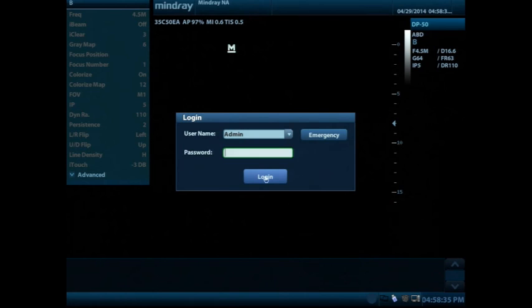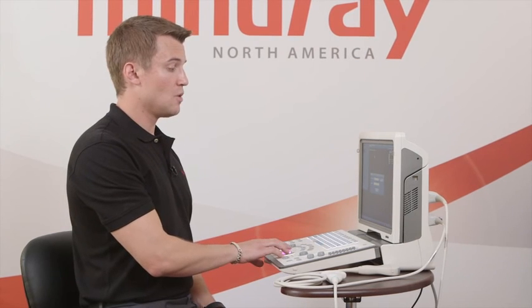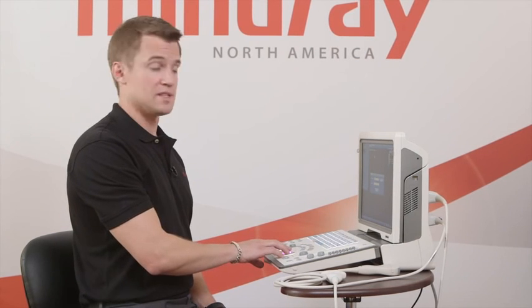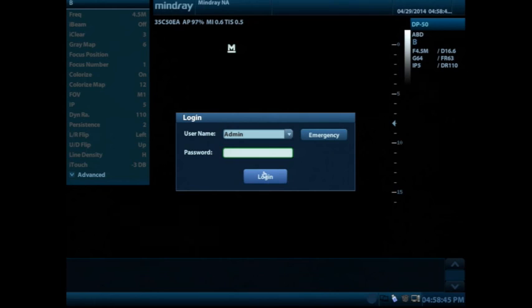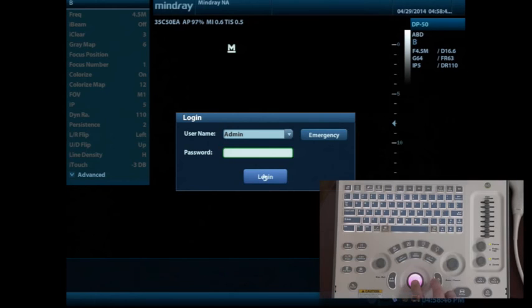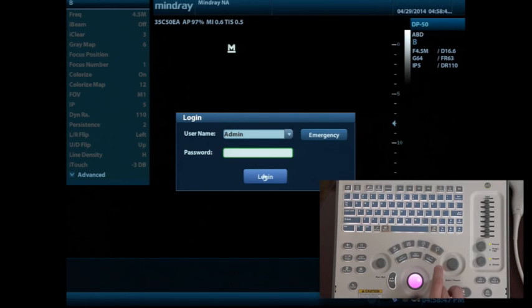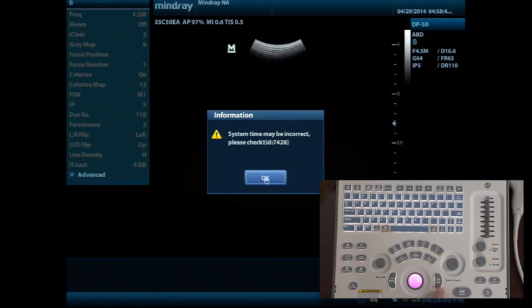So as we boot up the machine, we see that it has login information. This will come up automatically. There is no password that's involved, so what you'll do is you'll use the trackball and the set key in order to just click on login.